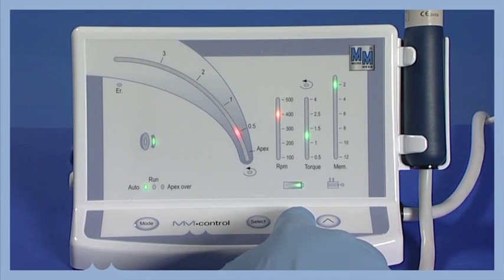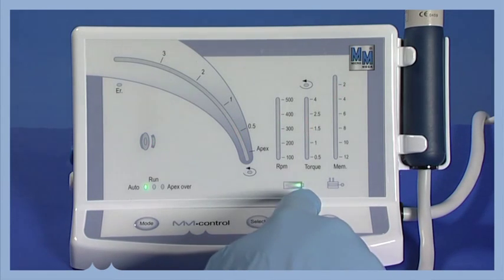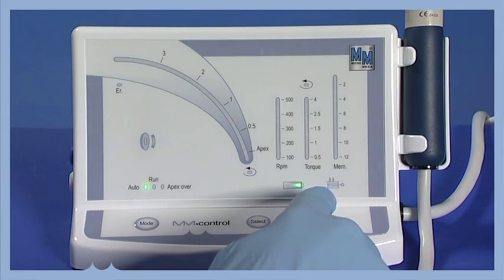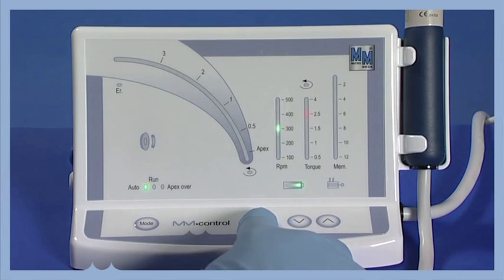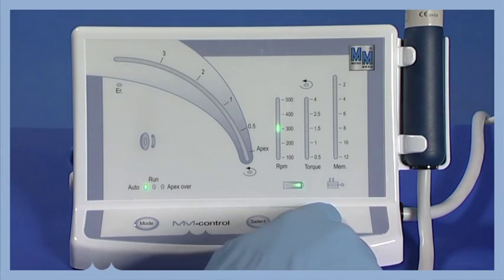Select the program to be memorized. Validate. Select the torque. Validate. Select the speed. Validate. Determine the apical distance.